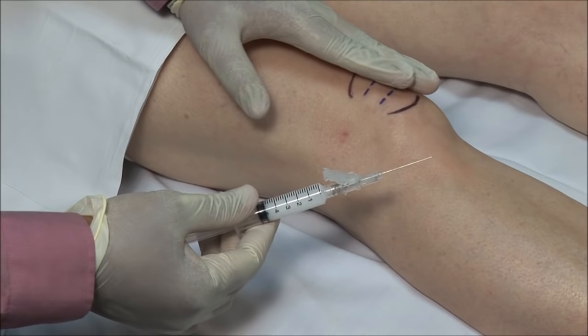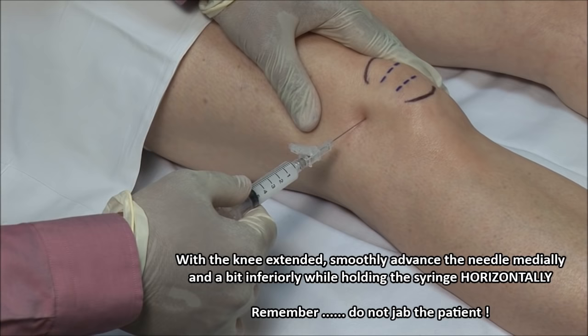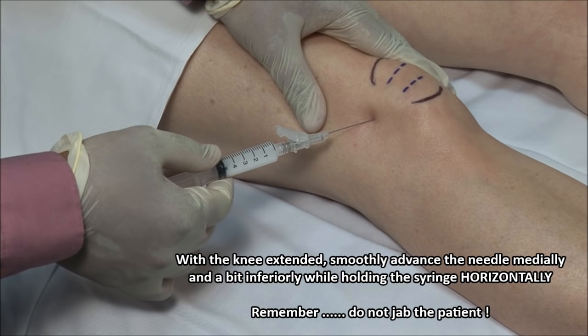Apply pressure on the patella medially to tilt it up laterally and open up the joint space. Advance the needle gently through your mark, aiming medially and a bit inferiorly with the syringe held horizontally.